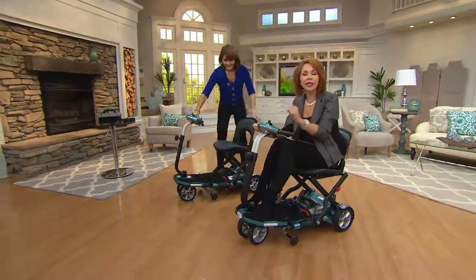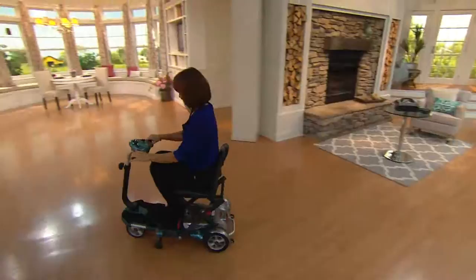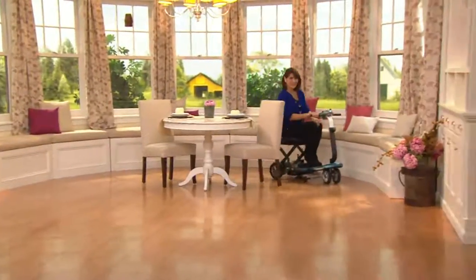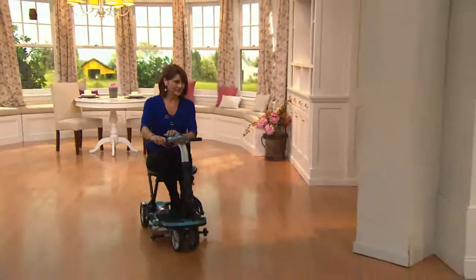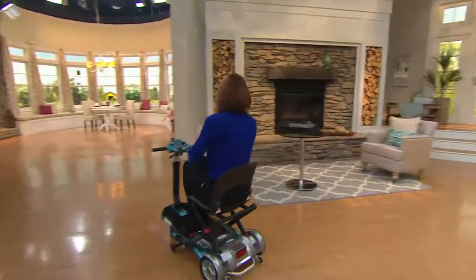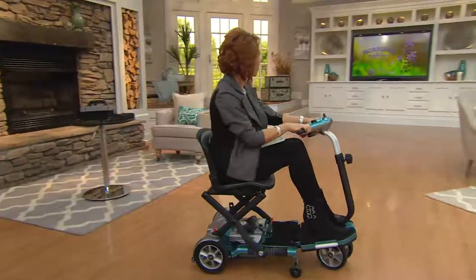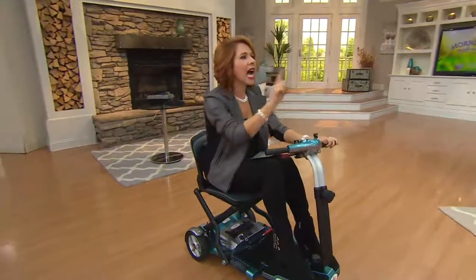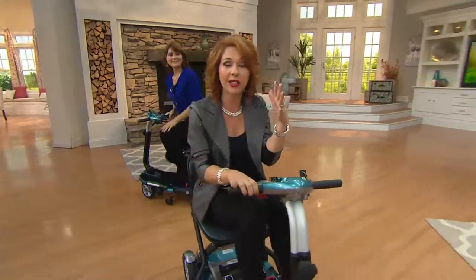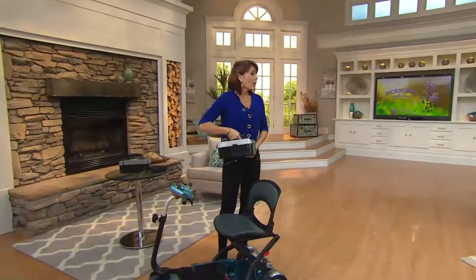This is a while-supplies-last item. We went directly to EV Rider and got a lot of these in — the more we're able to get in, the better value we can compile. When it's gone we will not be able to reorder it, and instead of marking the price up we're passing the savings on to you. The price is $1,599, with six easy payments available. A full charge gives 10 to 15 miles of distance, and it charges fully in about two hours — you could use it in the morning, charge over lunch, and be ready to go again.